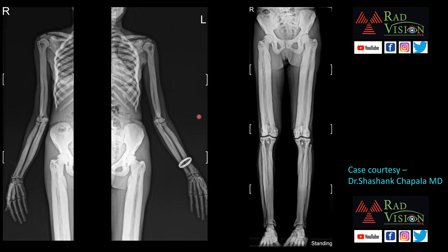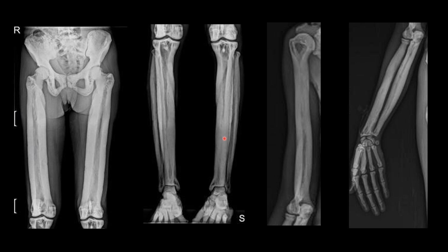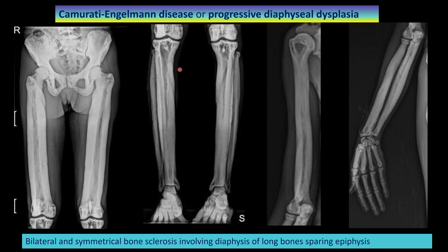The next case is a long bone skeletal survey and standing radiograph — thanks to Dr. Shashank Chapala for contributing. There is symmetrical bilateral sclerosis involving the diaphysis with sparing of the epiphysis, i.e., diaphyseal sclerosis involving all long bones. This is a classical case of Camurati-Engelmann disease or progressive diaphyseal dysplasia.